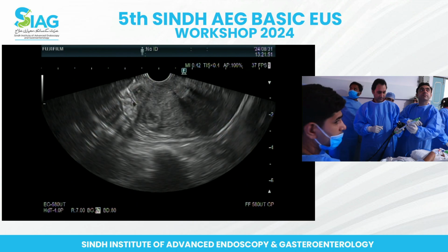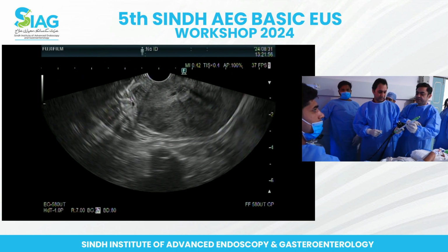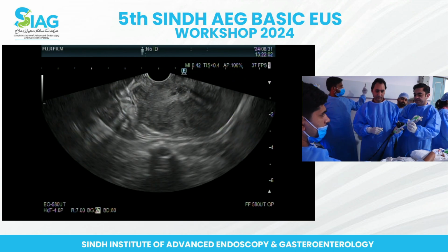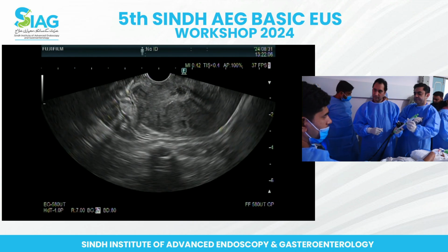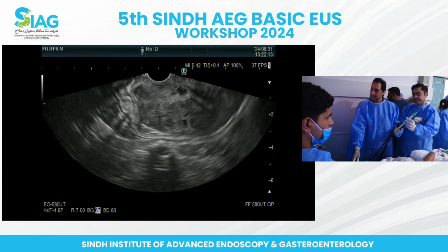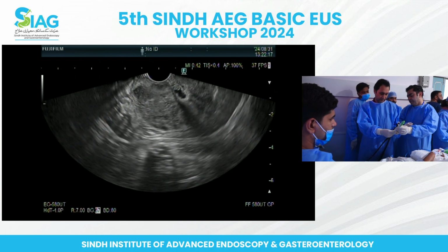Yeah. So we can see now, so just for the trainees, the lower dial here is the distance the sheath will come out of the needle. So you don't want the sheath out too much when you put this needle down the scope. Usually keep it less than 2 centimeters. Then put the needle down and lock it into the scope. Okay. And then under visualization, you can then advance your sheath.